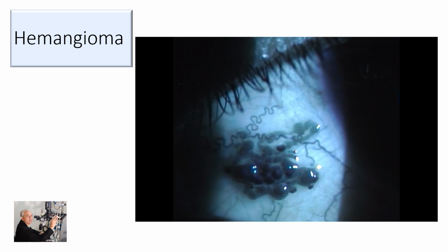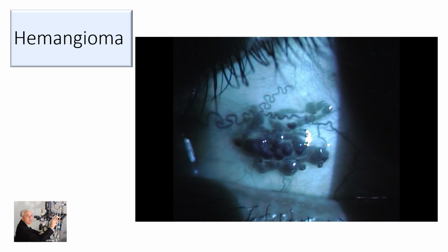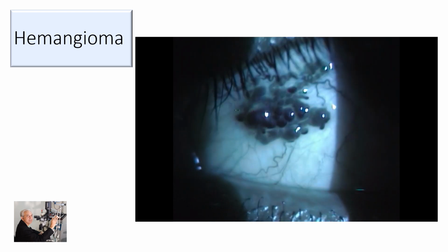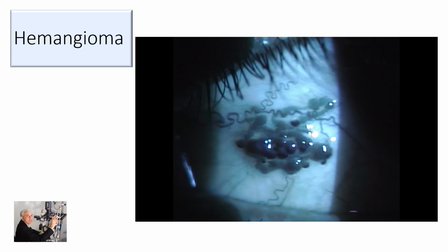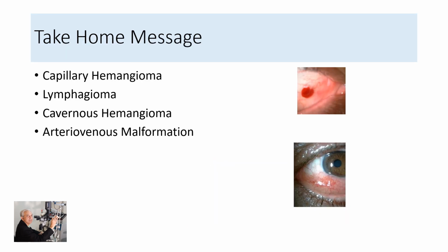You can see the blood over here, and the blackish areas where there's more stasis of blood, which you see in these patients. So the red-free filter is a useful filter to highlight these lesions in these patients. So let's see what the differential diagnosis of these patients is.